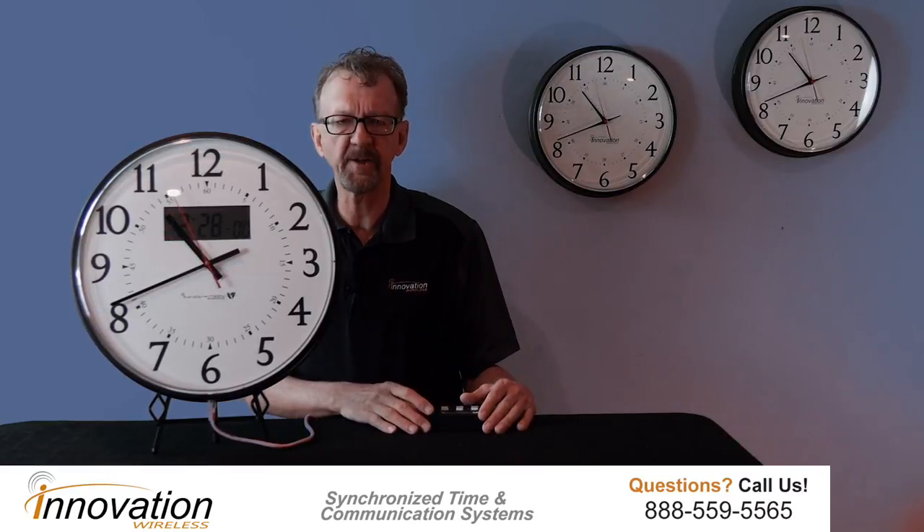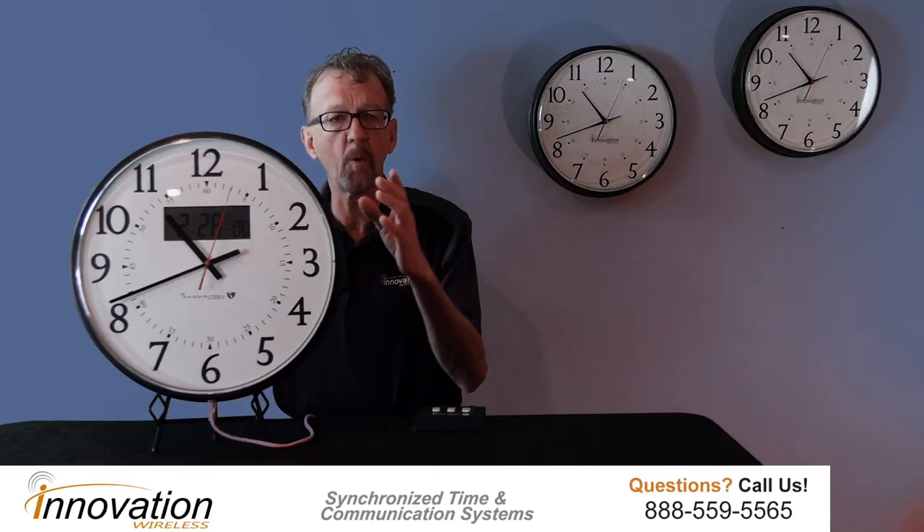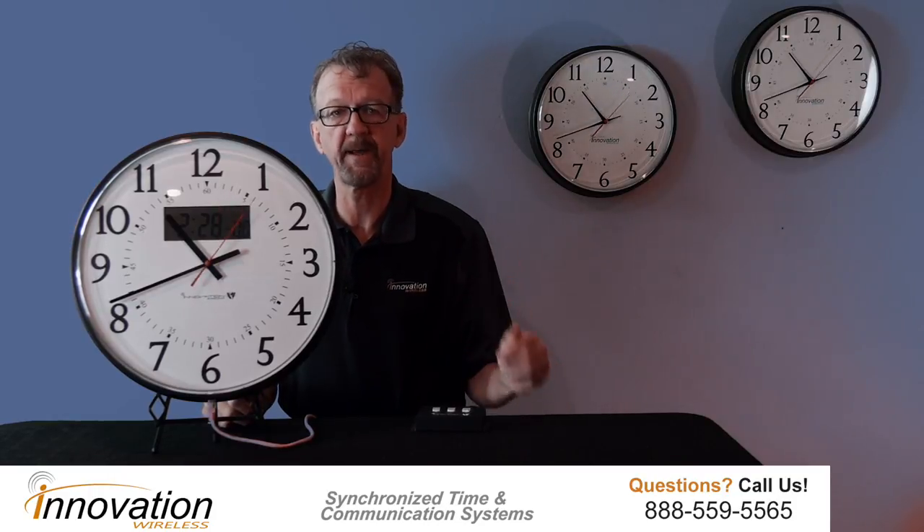The combination of this analog clock and timer is available in a 16-inch black casing that you see here, or a 13-inch brushed aluminum casing.